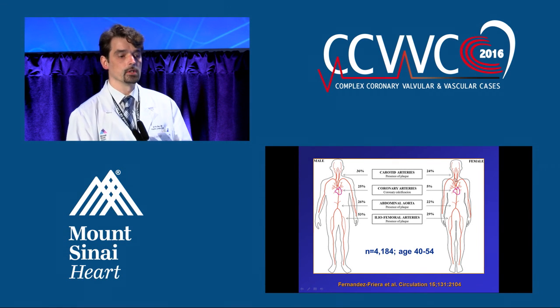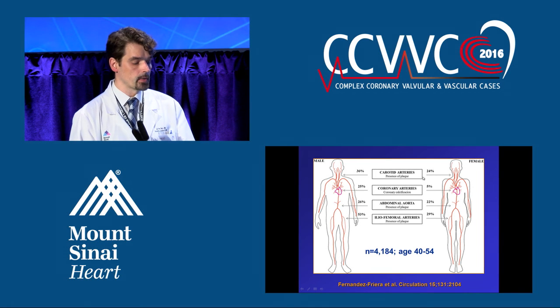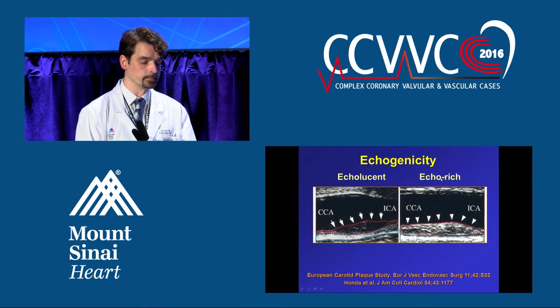So where can we use the ultrasound? We can do it in the carotid arteries, we can do it in the aorta, and we can do it in the iliofemoral arteries. And if you look at this study, this is being performed in Spain. It's called the PESA study. So actually, the more prevalent area for plaques is the iliofemoral arteries. However, most of the data comes from the carotid arteries.